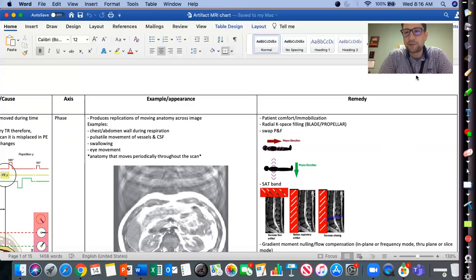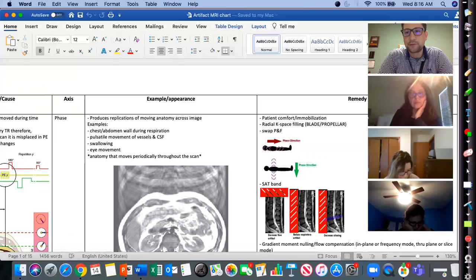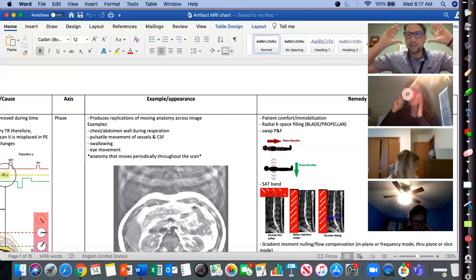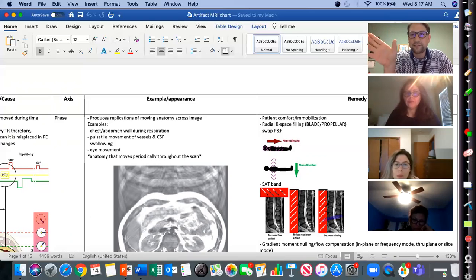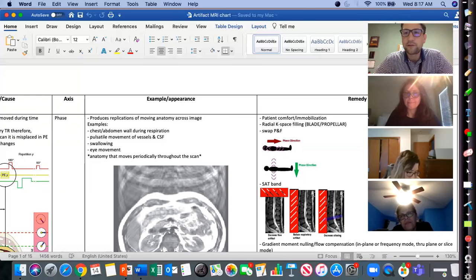Okay, we're not just button pushers, right? Just like in X-ray, we're not just button pushers. The MR system is getting smarter and smarter to the point where the AI technology is able to localize where the brain is. Even with the AI technology, it even sets up your slices sometimes because it can detect where that anatomy lies in the scanner. And then we already know that the physicist sets up these protocols. And if it was a perfect patient, sometimes in the MR system, you can basically lay them on the table, grab that protocol, swing it over to the left, download it, and run it. And you would probably get some decent images.